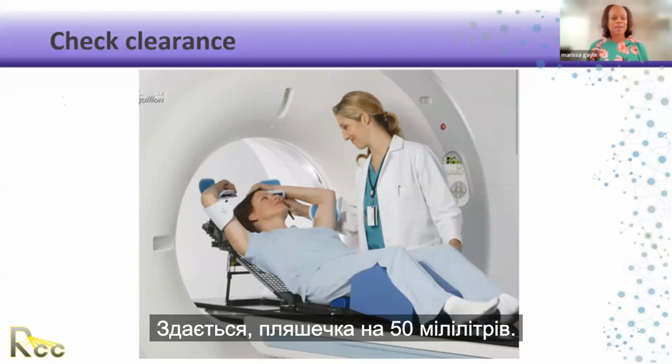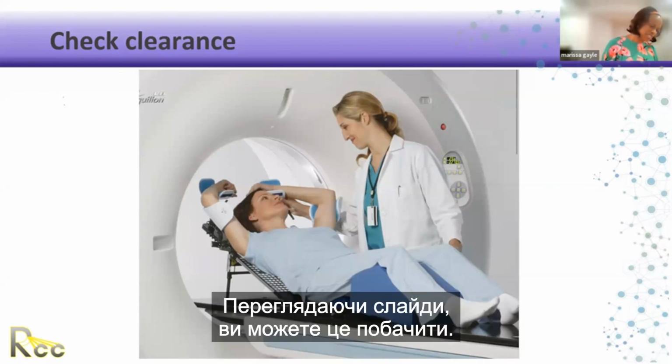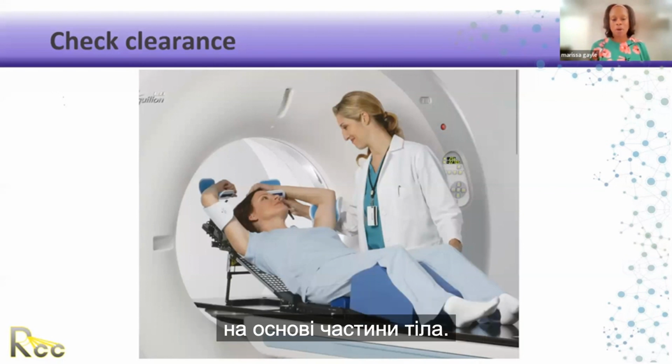I believe the bottle is 50 milliliters. I do have a slide in here. Going through the slides, we may see it. I'm basing this on my memory, and we have a machine that automatically dispenses it for us based on the structure, based on the part of the body.